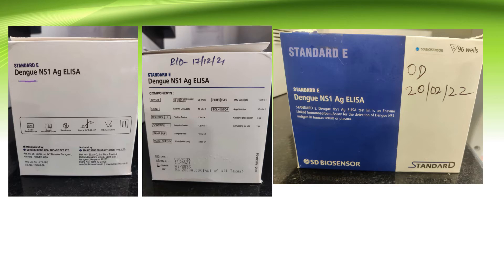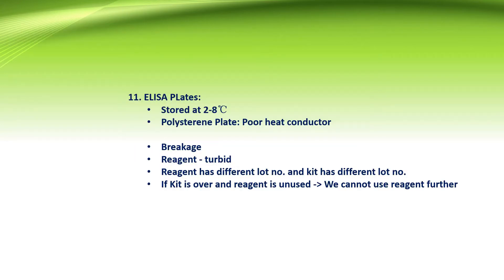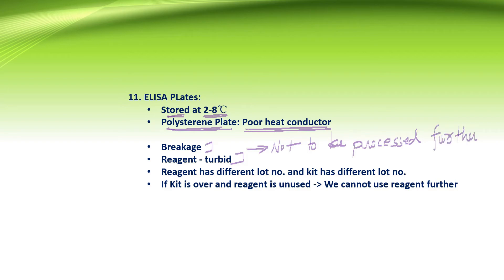Here is a picture of a Dengue ELISA kit. We can see RD and OD: RD stands for receiving date when we receive the shipment, and OD is the opening date when laboratory staff receive the kits to the department. ELISA plates are usually made up of polystyrene, polycarbonate, or polyvinyl material, which is a bad conductor of heat, and are stored at 2 to 8 degrees Celsius. Any breakage or turbidity seen in a reagent means it is always rejected. If the reagent has a different lot number than the kit, the kit cannot be used. If the kit is over and the reagent is unused, the reagent cannot be used further.